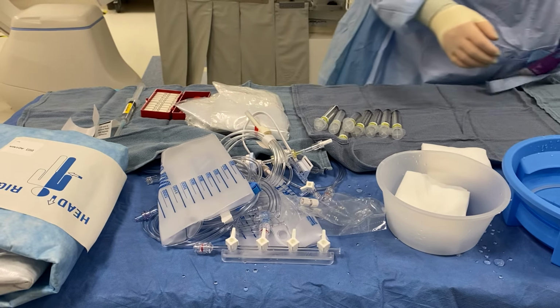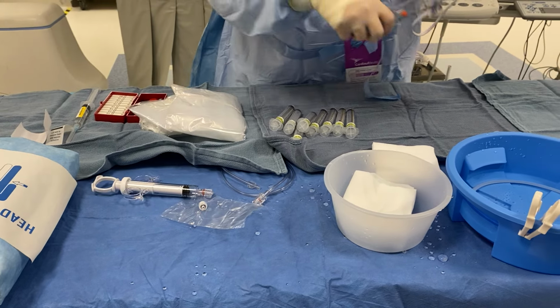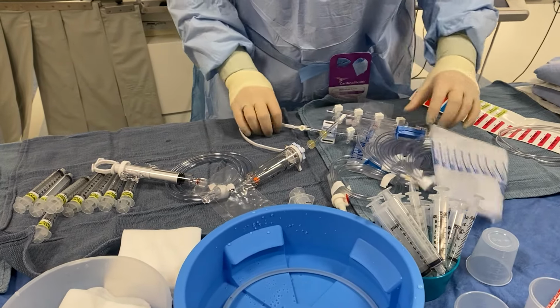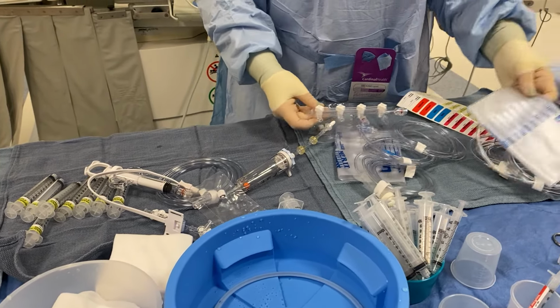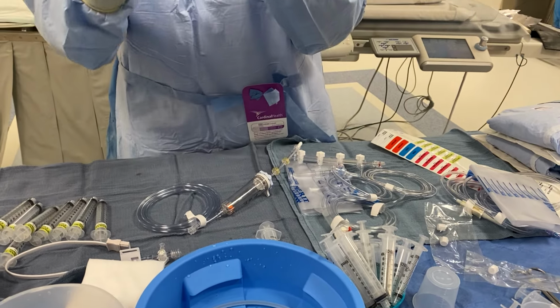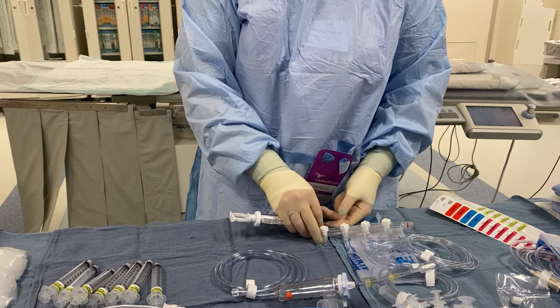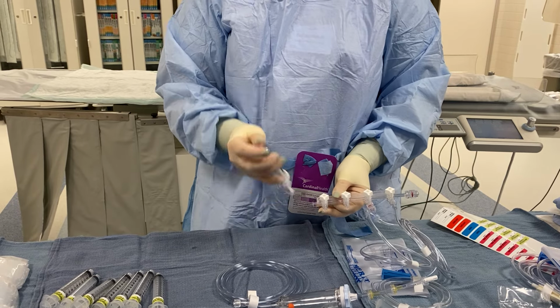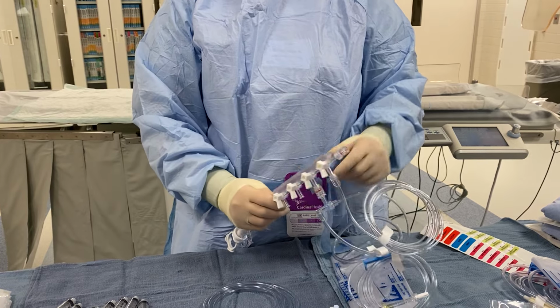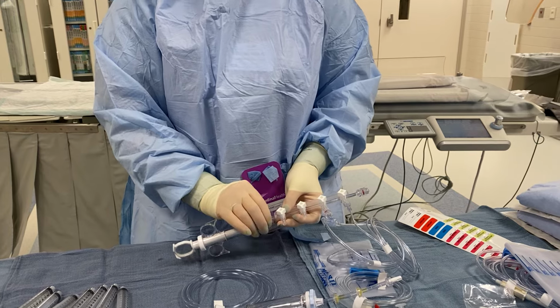My final step is I'm gonna set up our manifold. So I'm gonna grab all of that. So some of the things come disassembled on it, so we just need to assemble it. So we're gonna take our control syringe and put it right on the end. And you'll know which end to put it on because it can only connect one way. This is a male luer lock and this is a female port. So it's gonna connect here. This is a male luer lock as well, so we can't put those two together. So it's just gonna twist right on.